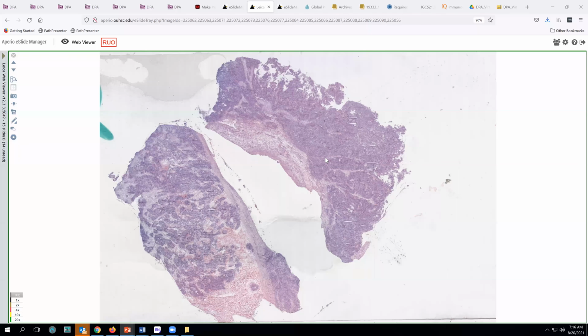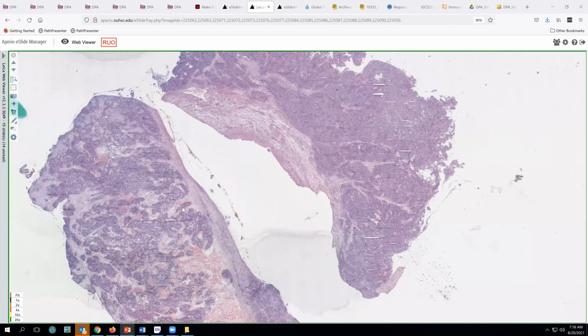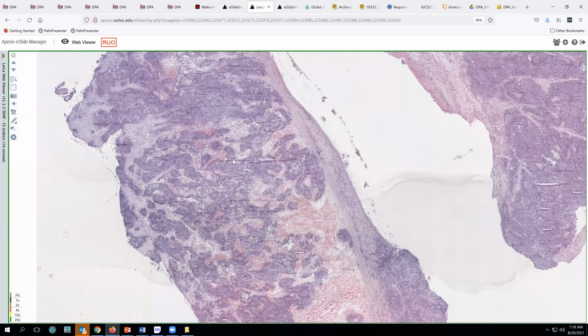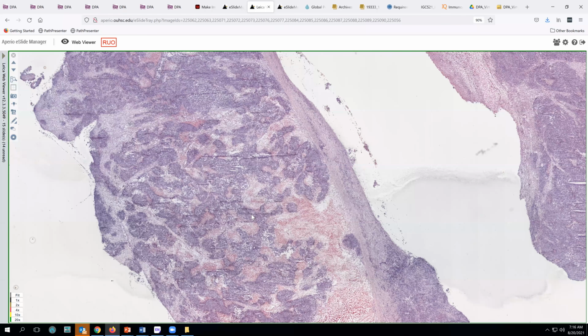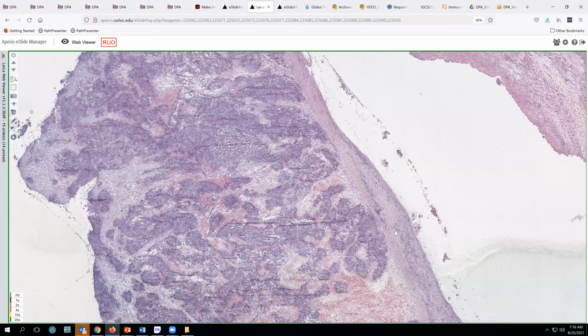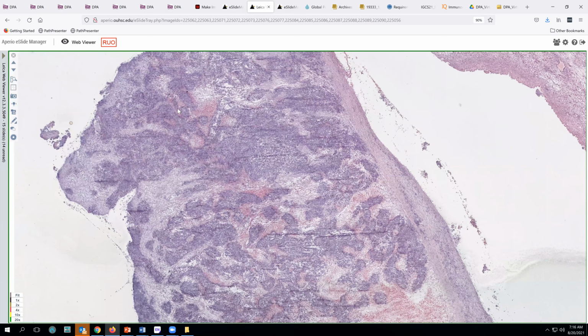And of course, as routinely evaluated in a young person, they did hormone markers and other tumor markers before surgery and did not detect any specific findings there. And so, of course, a frozen section was performed, and that's why this slide is of a little lower quality. As we can see at low power, it has nests and cords of blue cells with intervening areas of either necrosis or hemorrhage and a little bit of ovarian parenchyma surrounding it. It did not appear to be involving the surface. It's mostly solid.